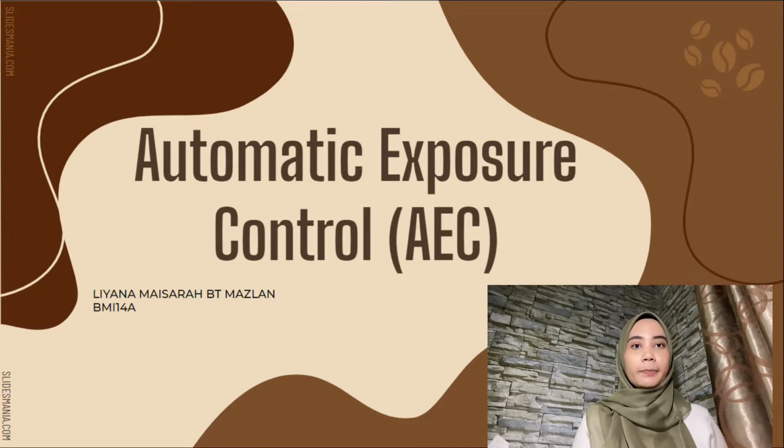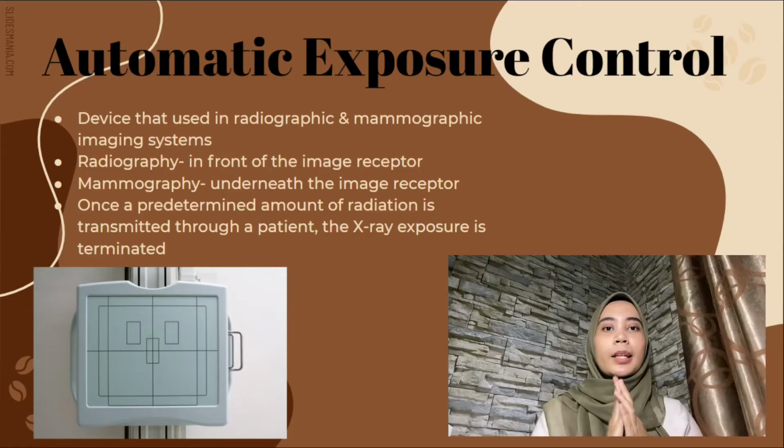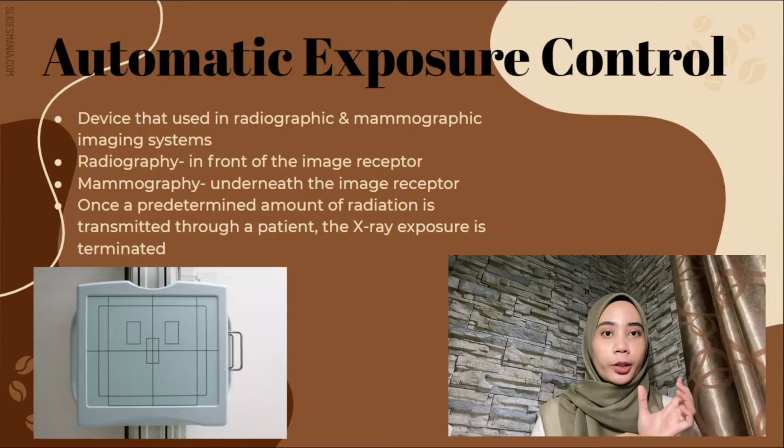So today I'm going to present about Automatic Exposure Control, AEC. Okay, so what is actually Automatic Exposure Control, or we can also call it AEC? Basically, AEC is a device used in radiographic and also mammographic imaging systems.